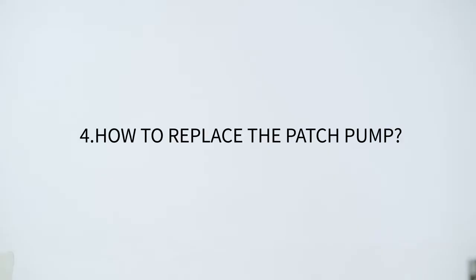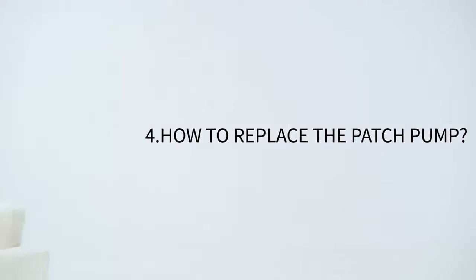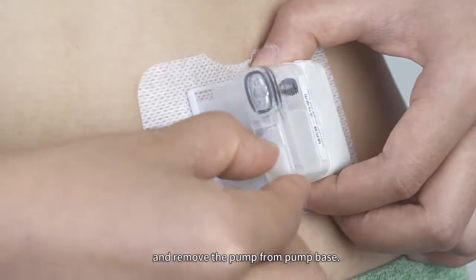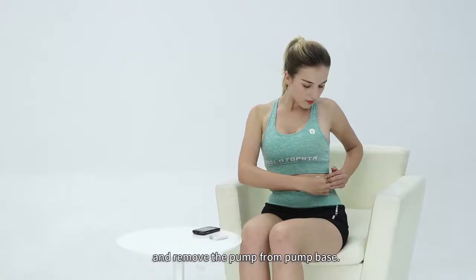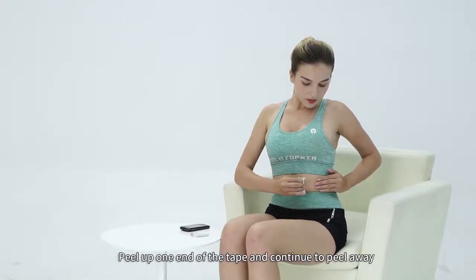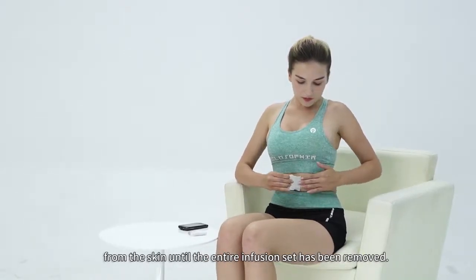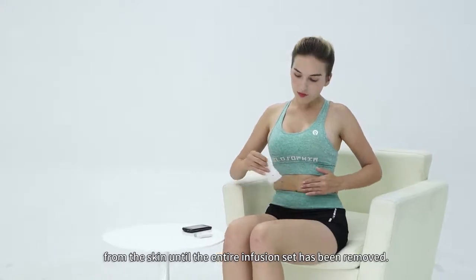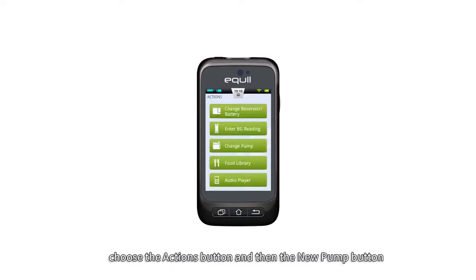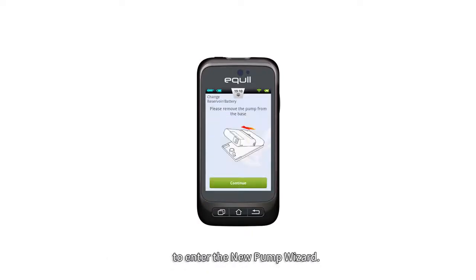4. How to replace the patch pump. Slide the white button on the top of the reservoir and remove the pump from the pump base. Peel up one end of the tape and continue to peel away from the skin until the entire infusion set has been removed. From the home screen of the PDA, choose the Actions button and then the New Pump button to enter the New Pump Wizard.